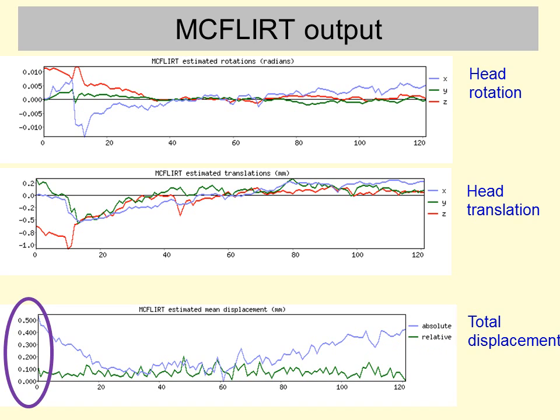This one is telling you about how much they've moved on a particular image compared to the image before it in the series. So it's just how much have they moved over the last two images, basically. And that's actually really useful, as we'll see on the next slides.